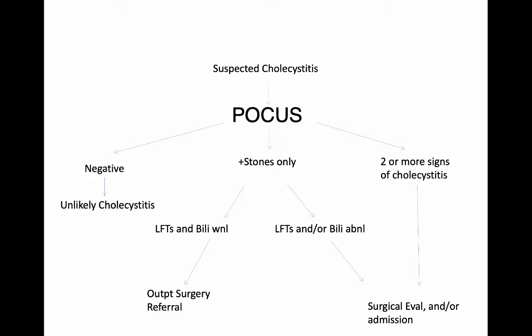So what I suggest, and what I do in my practice, is ultrasound them to see if it looks like gallstone pancreatitis or not. So do they have signs of cholecystitis? Do they have a dilated common bile duct or not? That will help me decide whether this looks like gallstone pancreatitis. And then generally I will look at the pancreas, look around and see if there's a giant pseudocyst or some obvious mass or something like that.